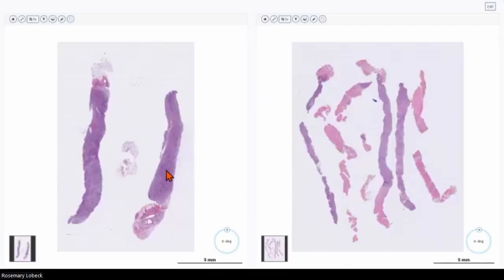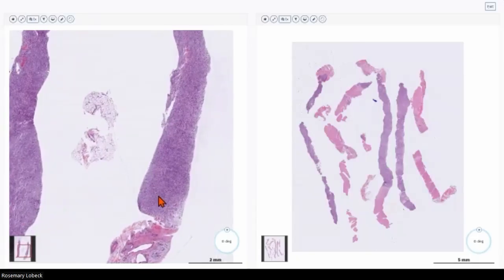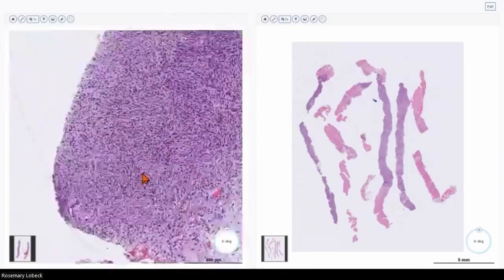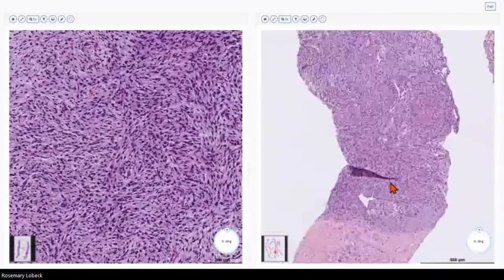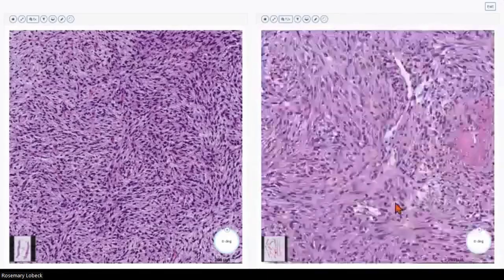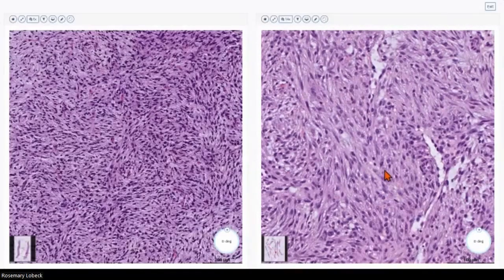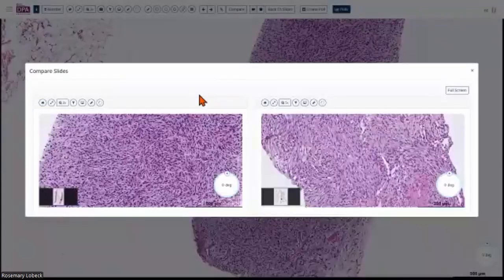So this is our case of myxofibrosarcoma, which we just saw in this older patient with a large subcutaneous mass. So myxofibrosarcoma can be very tricky because unlike most soft tissue sarcomas, it occurs in the subcutaneous tissue and not in the deep muscle. So I zoom in on my myxofibrosarcoma, and then you can pick any area in this nodular fasciitis, and then just zoom in, right? So you could see how these look very similar, right? So without the proper clinical context, it can be almost impossible to distinguish between these two lesions. But when you do look carefully, you will see the nuclei are very hyperchromatic in the MFS, unlike in the nodular fasciitis.